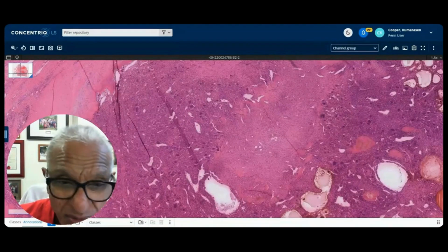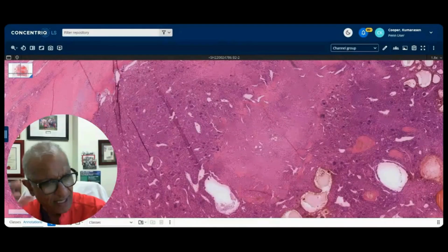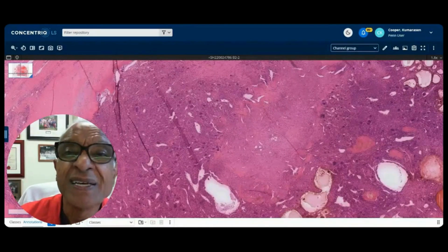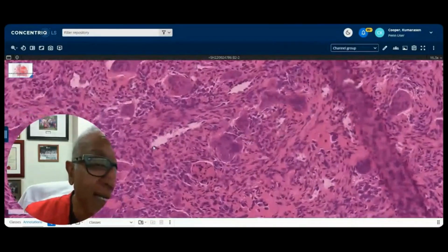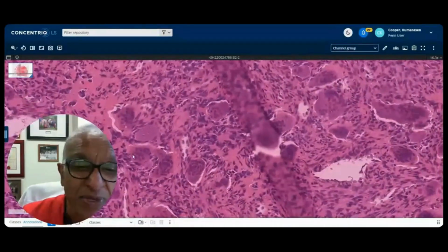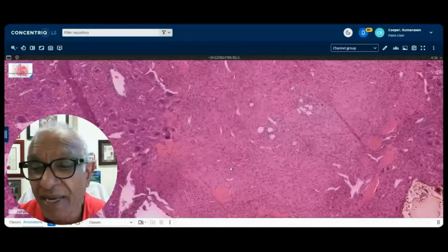Can it be osteosarcoma, Ruhani? The answer is twofold. The first part, which I answered already to Dorothy, is that radiology plays an important role in that respect. And then microscopically, you'd want to see osteoid production in an osteosarcoma in and amongst cytomorphology that looks malignant. These look very bland. They look a little cellular, but they're bland. There are no mitotic figures. There's no atypia or varying size and shape of nuclei. So they look very bland. Here you can see a predominance of spindle cells, and even here they look quite bland.